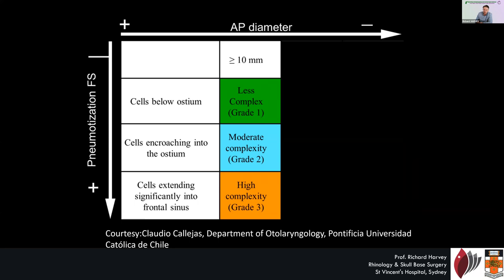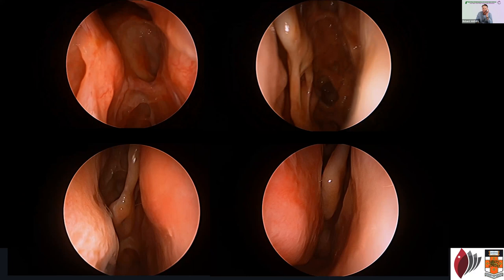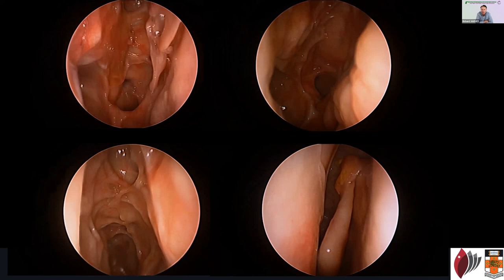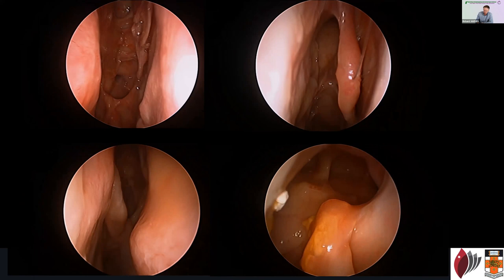It is just the number of partitions there. Once you do that — and we started using this technique in tumors and in people that are hyperplastic — it's now what we do every single time. It gives us these lovely sinus cavities that have a very big, sort of middle meatus opening and a really nice final look. Even if it scars down a little bit around the top and the apex, most of the time you still end up with a very nice opening. In the bottom right-hand corner, we've almost extended it across, and you might even call that a Draf 2B or a hemi-Lothrop.